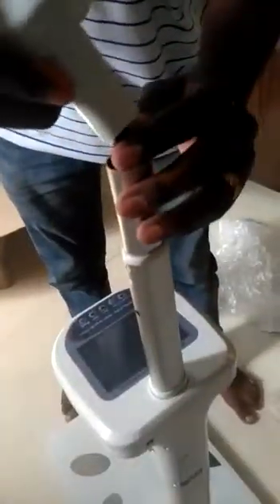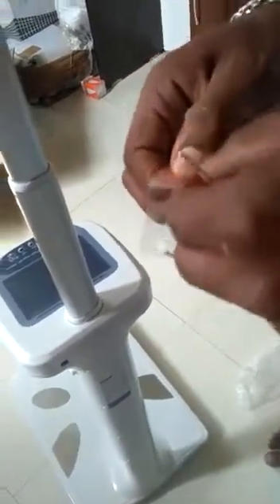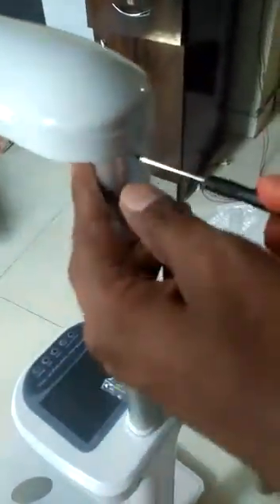There are three steps for the port: first insert this one layer, then here you can fit the one pin. We have been given small three screws and also a screwdriver along with the scale. Now the remaining three screws — put one here and one more here. You only have to fit three screws.